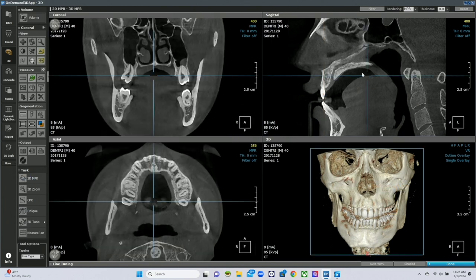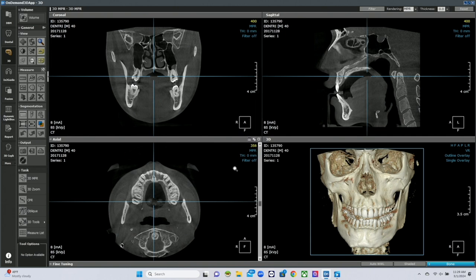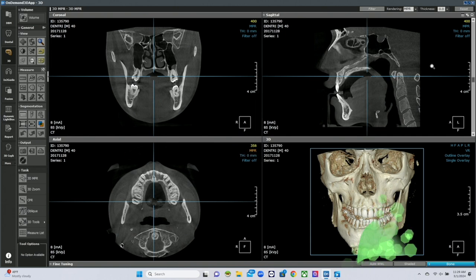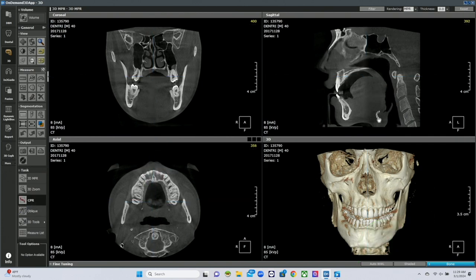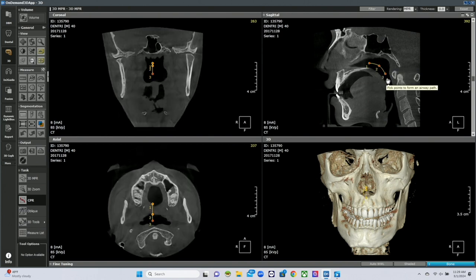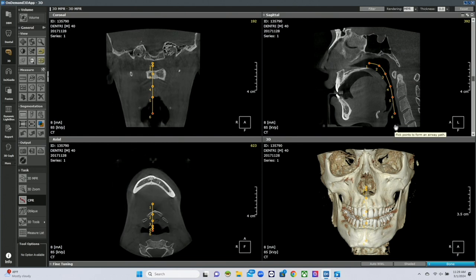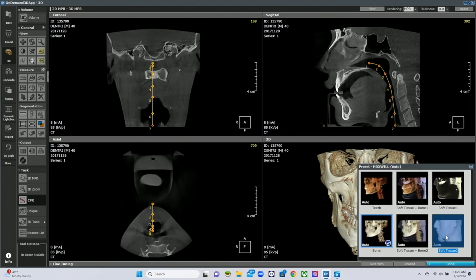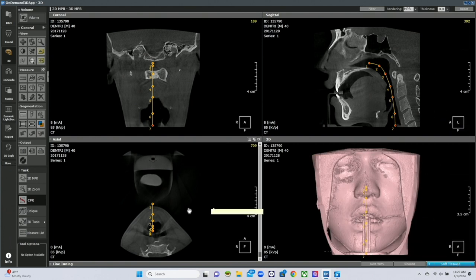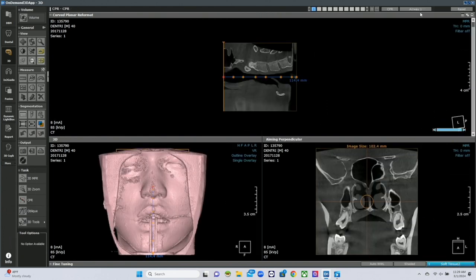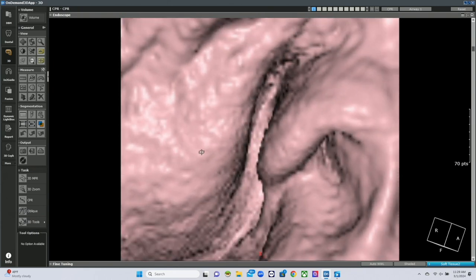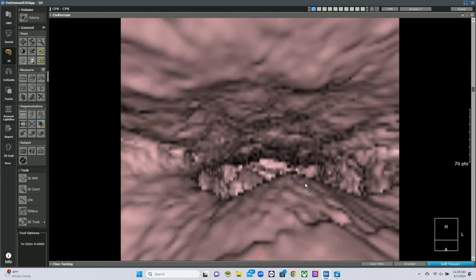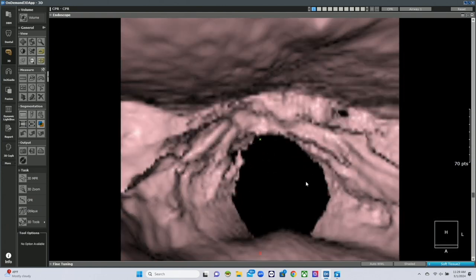Moving to a larger field of view, we can see the whole airway — from the nasopharynx down. We have a tool where we can actually create an endoscopy and look down the airway. Turning it into soft tissue, I can actually fly down the airway and see a tonsil here and a tonsil here. Turning the corner — there's the soft palate, the back of the tongue. We can actually fly past the epiglottis and into the airway itself.